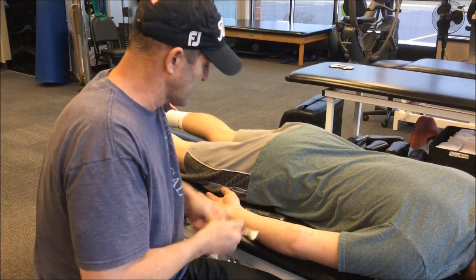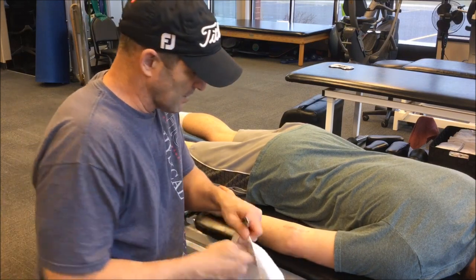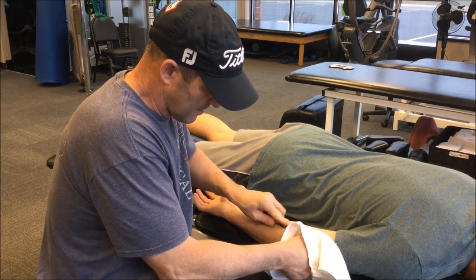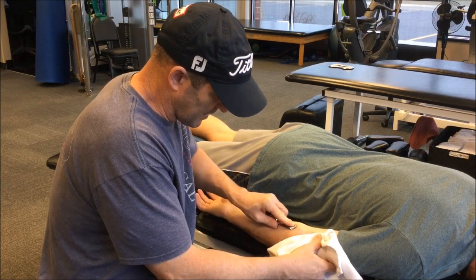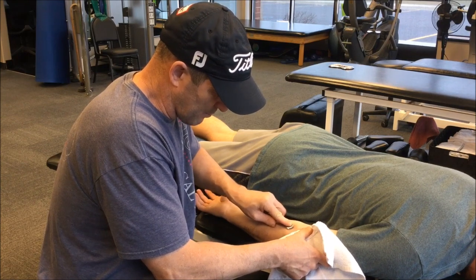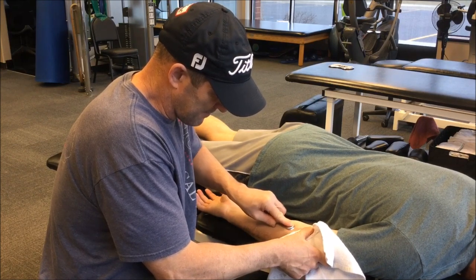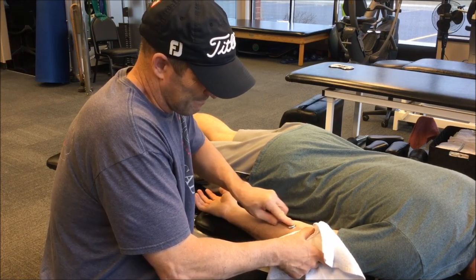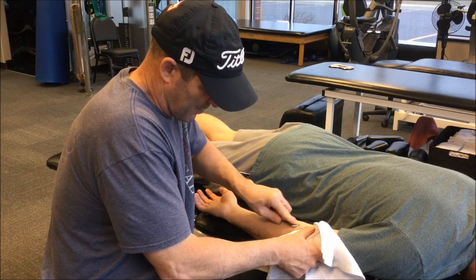When I find that point of tenderness, I'll switch tools and sometimes push my thumb down. I'll grab the tool — I'll usually bring a towel so I get a little better grip — push down, then take the beveled edge and focus more on that spot, applying a downward pressure and working right on that spot. Sometimes I'll stuff a sock in the athlete's mouth so they can't cry. Max is somewhat tough. I'll work on that for about 30 to 45 seconds.